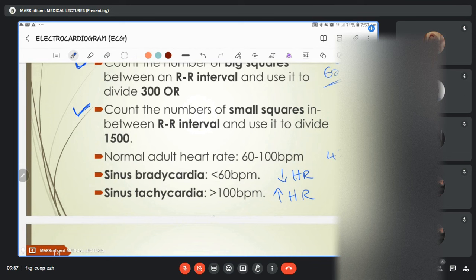Tachycardia can come with hypertension and all of those things, but bradycardia can come with hypotension. Even physiologically, tachycardia can come, maybe the person is an athlete. The heart rate has to increase to compensate for those activities. So all of those things put together, it is going to help you narrow your intelligent guess.